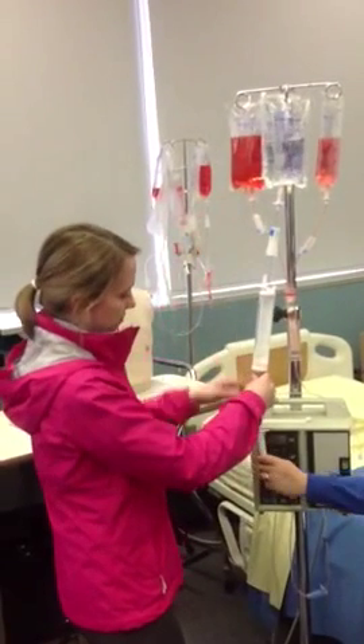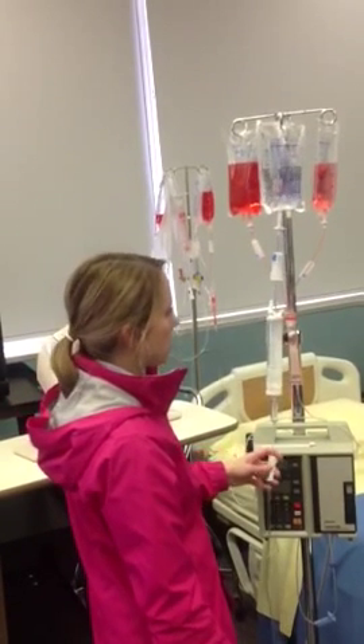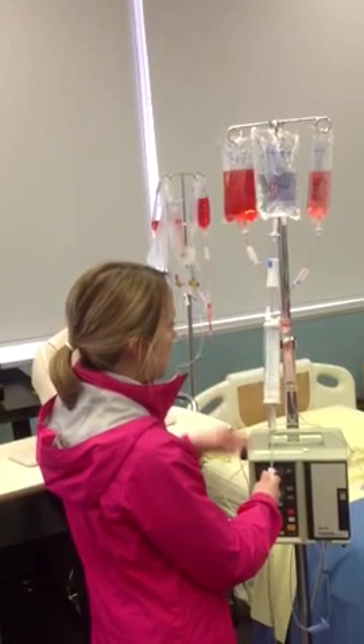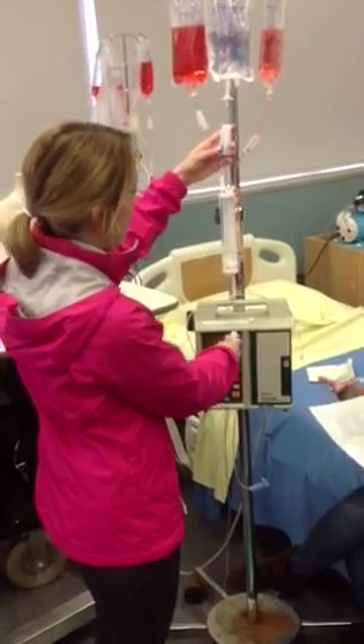After you prime it, if there's not enough fluid you open the top clamp to refill. So you set it for 30 to prime it, and then go back and refill it to whatever the order says — you set it up to the order.